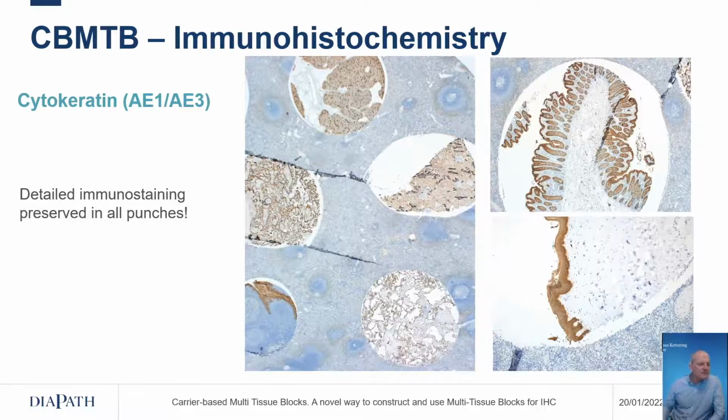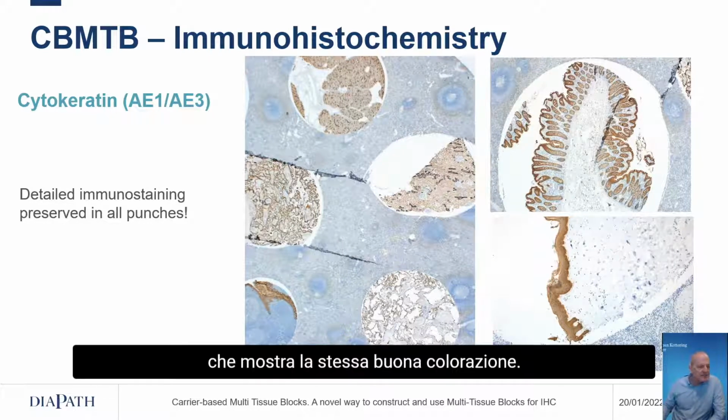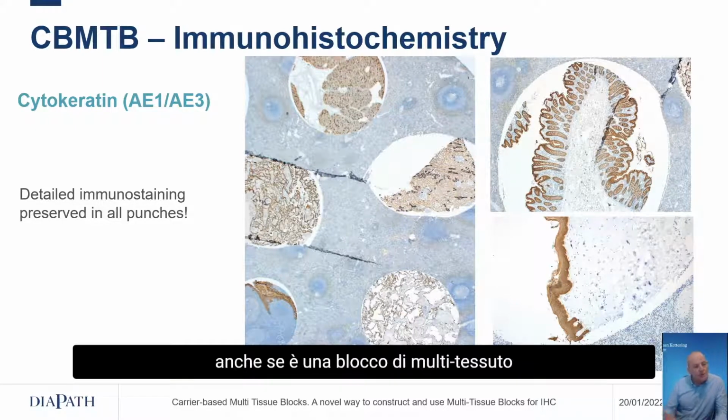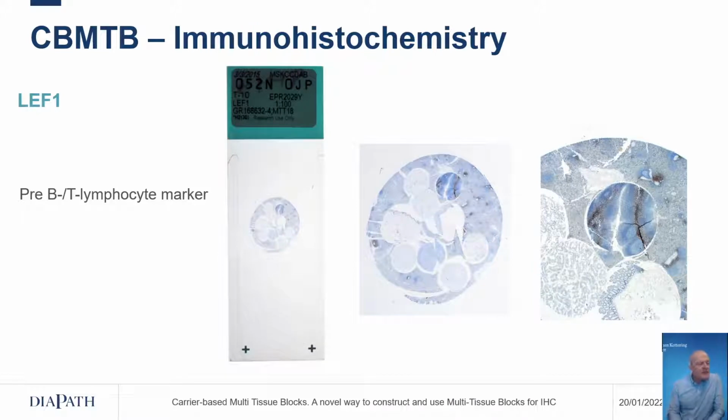And then another, this is the higher magnification illustrating the same good staining. This is placenta, this is the kidney, this is lung, and this is pancreas, and all the positive structures actually remain positive, even though it's a multi-tissue sample. So there's technically no problem that the tissues are not covered right, or because maybe the lung wouldn't stain well. No, it stains perfectly.